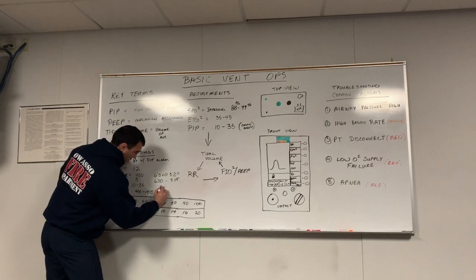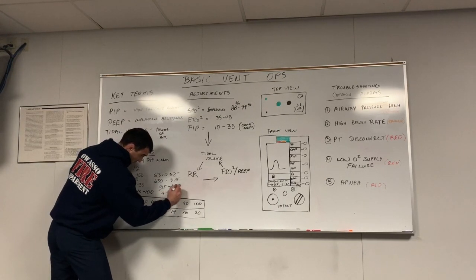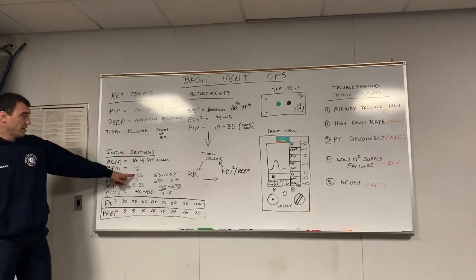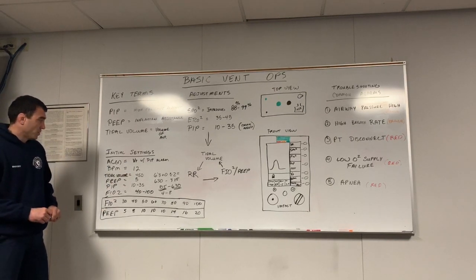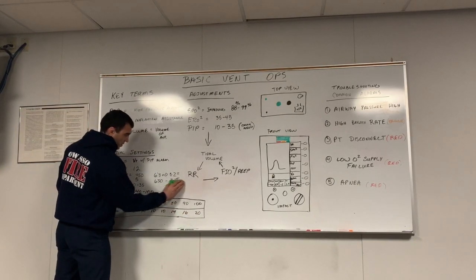So if I flip that around on my vent setting, if you were to use a chart for your 4 to 8, that's the setting. So this is my low end of my setting, and this is the high end. So if you look for 450 for me, that starts right in the middle. That's pretty good for me, okay? The problem with this initial vent setting, okay, is that most people we deal with aren't 6'3".